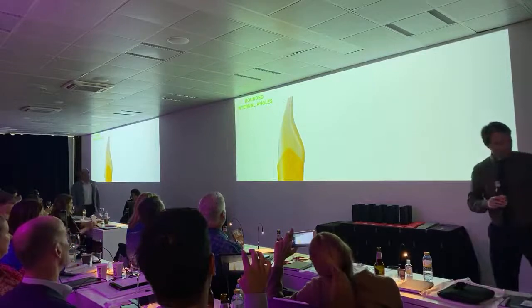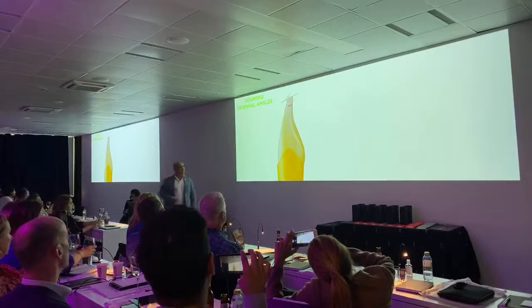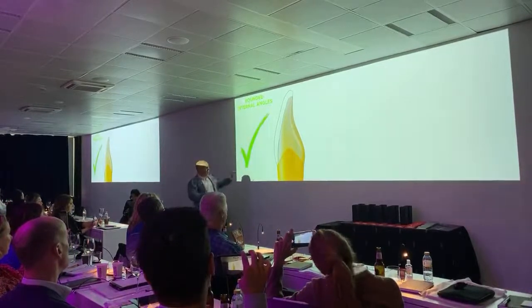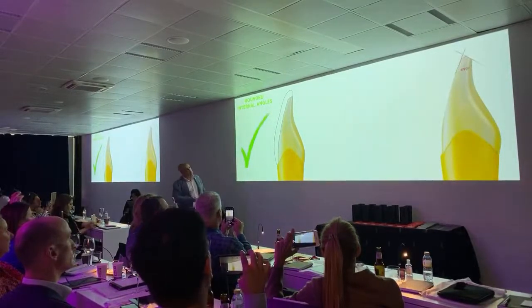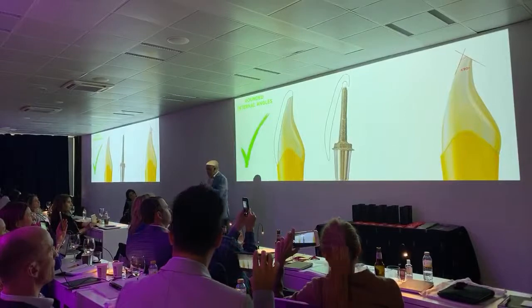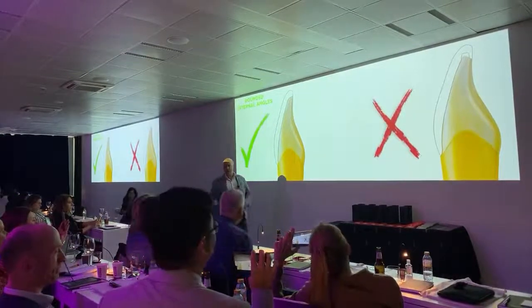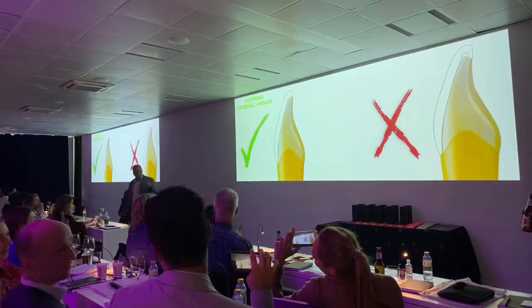Rounded internal angles. This is the best option for the incisal edge because it's easy for the milling machine to mill this angle, so it can fit better. If you prep like this, it's impossible for the milling machine to do this without over milling. So when we put it in the mouth, there's more space for the cement, so it's easy to break.